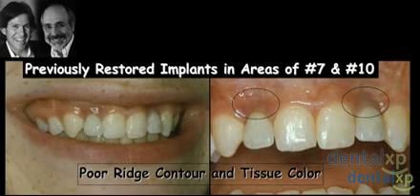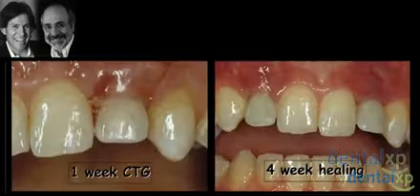Is it a type 1 case where we have a great ridge and we can place the implant, thick tissue? Or is it a type 2 or type 3 case? In this case, a type 2 with a buccolingual deficiency or thin tissue type patient, we really try to factor in additional grafting at the time of surgery. And if this was done, maybe this wouldn't be what we would find in a case like this.